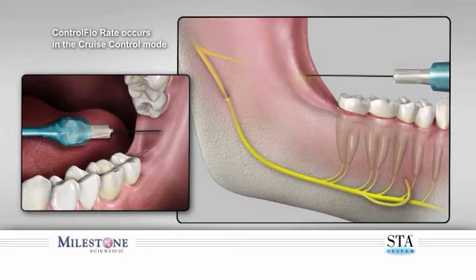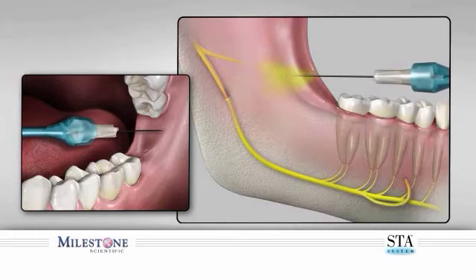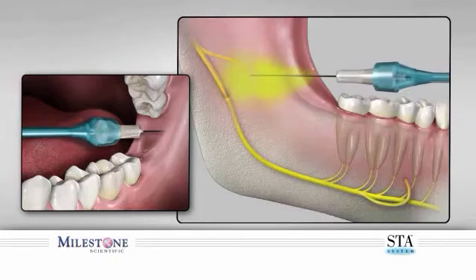tip of the needle. The technique of creating an anesthetic pathway does require a very slow and deliberate needle movement, allowing the anesthetic solution to deliberately precede the path that the needle will take. Slowly advance the wand handpiece and simultaneously rotate the handpiece using a clockwise and counterclockwise motion, which is called the bi-rotational insertion technique. This technique will minimize needle deflection, resulting in more accurate placement of the needle tip to the intended target. Advance the needle until bone is contacted.